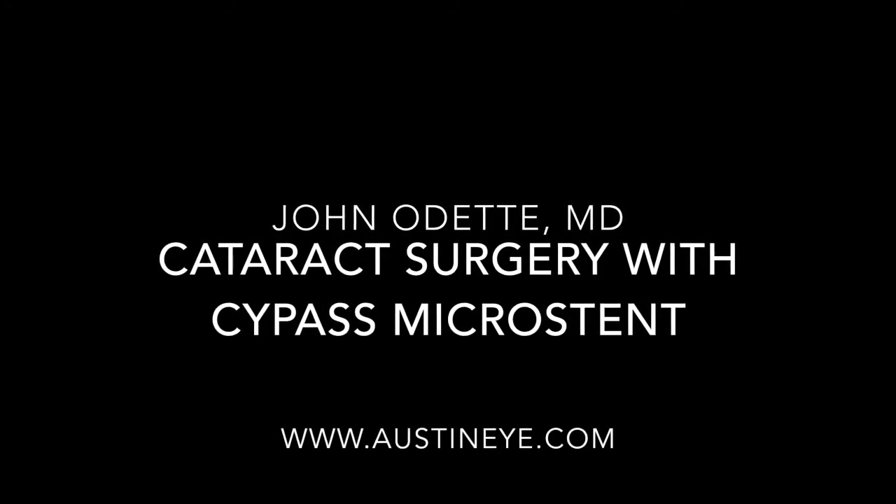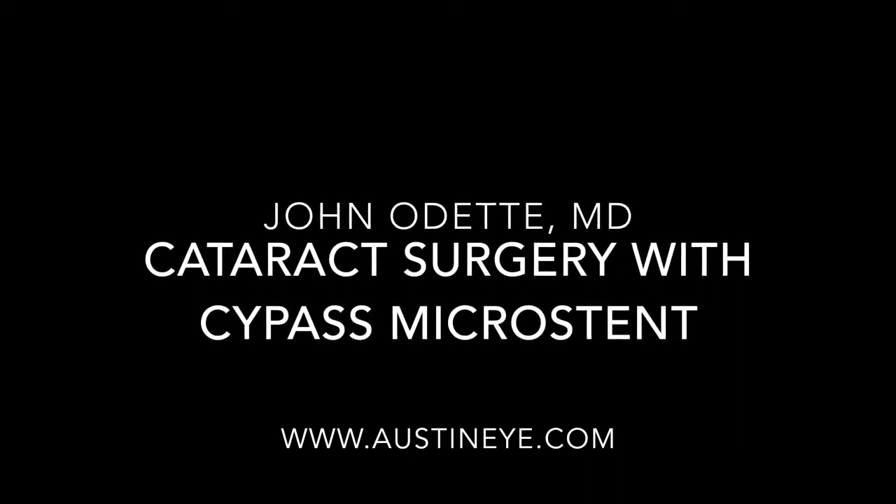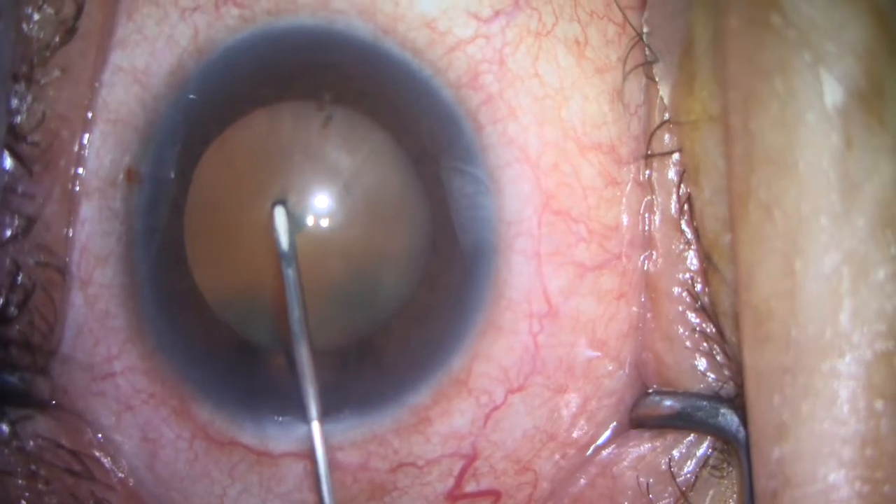This is Dr. John Odette. Today I'll be presenting a case of a cataract surgery with placement of the Cypass microstent for glaucoma.